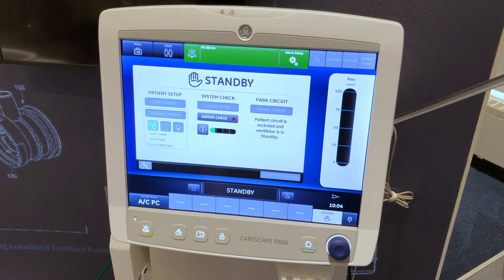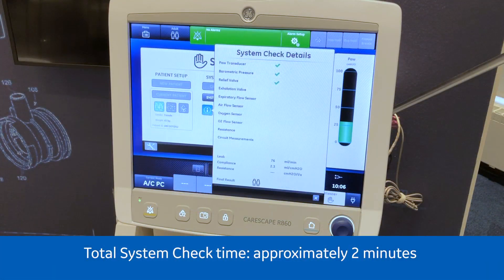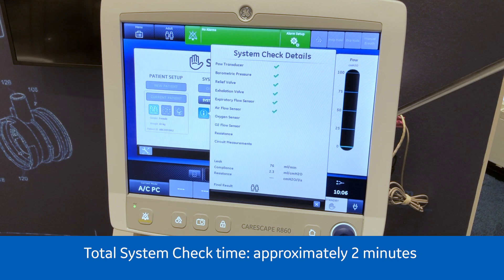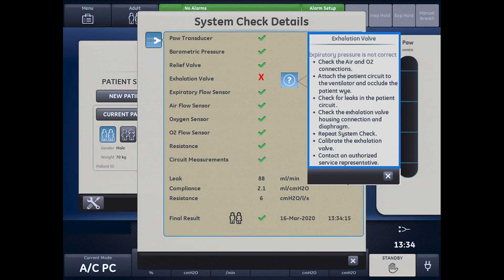Select the information icon to see the system check details menu. Follow all on-screen system check instructions. A green check mark will display if the check passes. If the check fails, a red X is shown and a help icon displays next to the failed check to provide possible causes and help for troubleshooting.